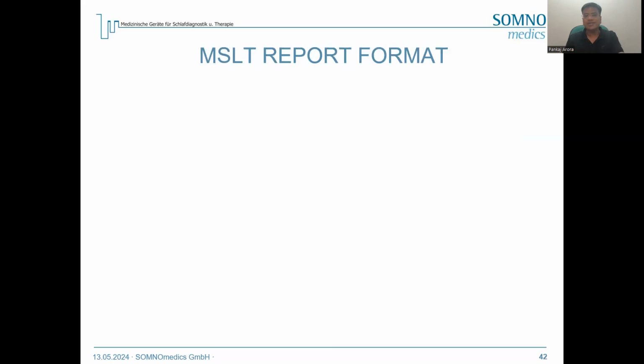You can also do the MSLT report. What is MSLT? MSLT is the multiple sleep latency test, which you do for the narcolepsy patient, for hypersomnolence, where the patients are feeling sleepy, not because of obstructive sleep apnea, but because of some other issues like narcolepsy or cataplexy or idiopathic hypersomnia. So you need to look at how you will confirm whether the patient has narcolepsy or not. You need to confirm with the MSLT test.